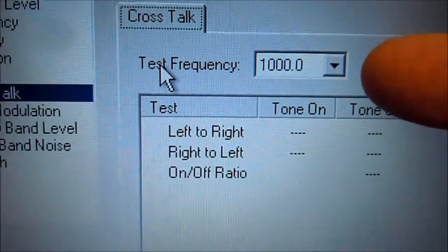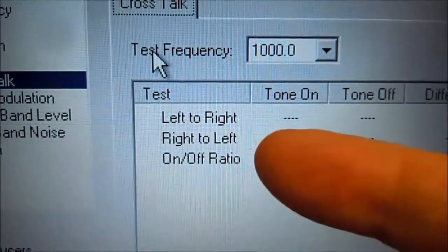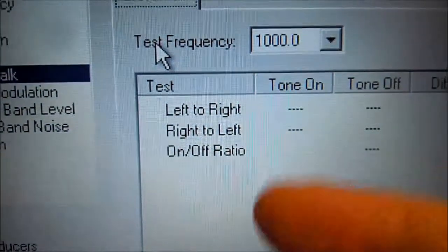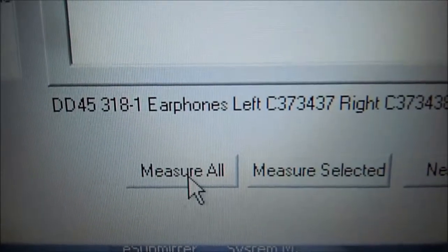Here we're going to set our frequency to 1000 Hz, and we're going to measure the left to right and the right to left microphones, and then we're going to get a ratio out of that. So what we're going to do here is come down and hit 'Measure All'.